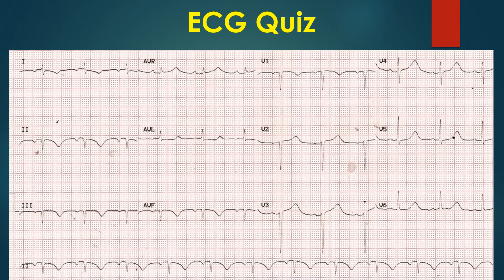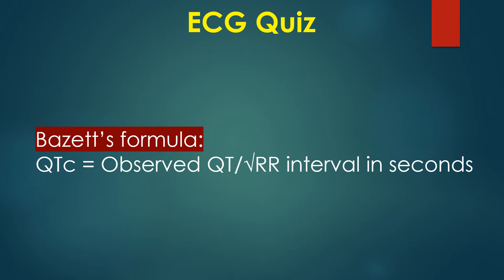Down-sloping ST with T-wave inversion is seen in lead 1. QT interval is 480 ms with RR interval 0.88 s. Corrected QT interval calculated by Bazett's formula is 511 ms, which is definitely quite prolonged. Hypokalemia, hypomagnesemia, and hypocalcemia have to be checked for. One would have expected lower amplitude of T-waves in typical hypokalemia. Bazett's formula: QTc equals observed QT divided by the square root of RR interval in seconds.